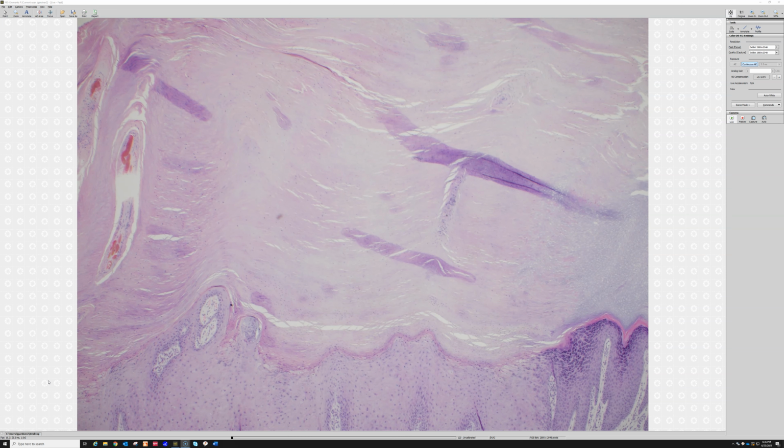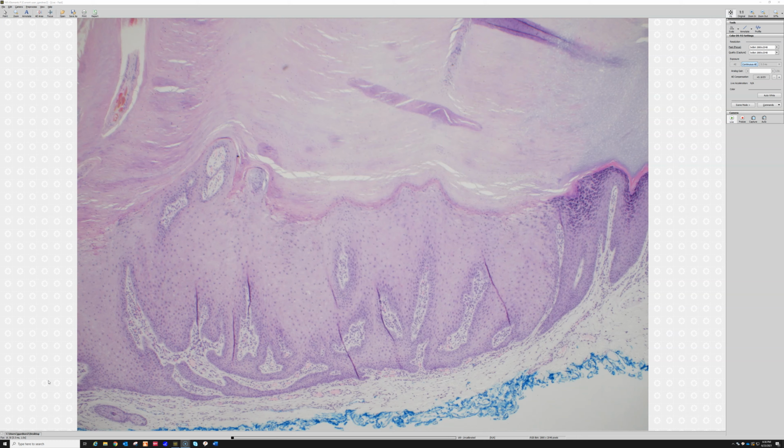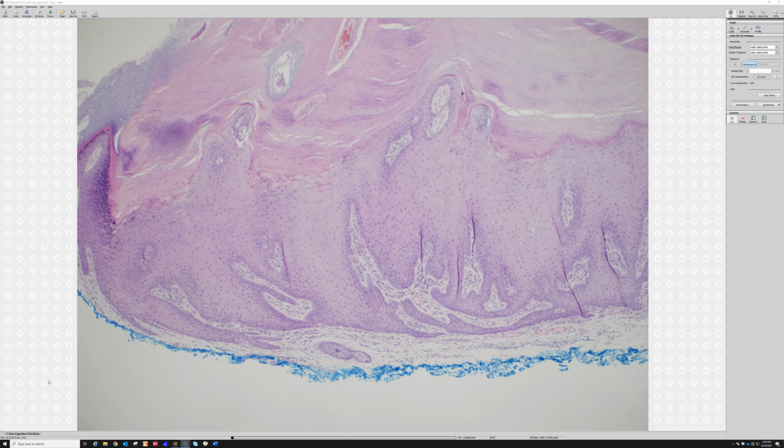All right. And I add some comment about that, you know, if nothing else, they need to follow the patient. And if it grows back or continues to grow, then they need to do a deeper biopsy or completely conservatively excise the whole lesion. But here, because we got a nice deep shave, this is helpful.